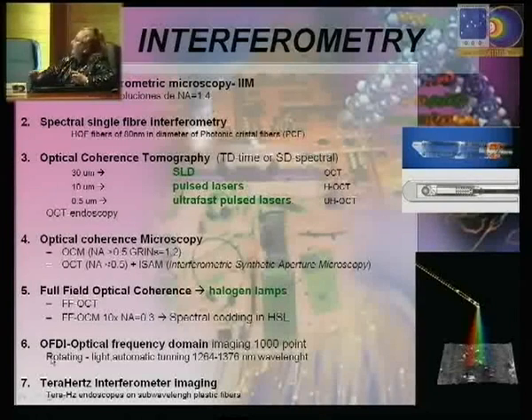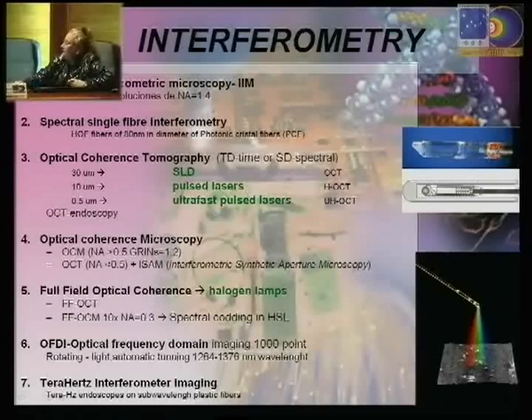So the top of the catheter rotates and furthermore moves the wavelength from 1,200 up to 1,400 nanometers, getting all that information simultaneously, so the imaging is around 1,000 points at the same time.